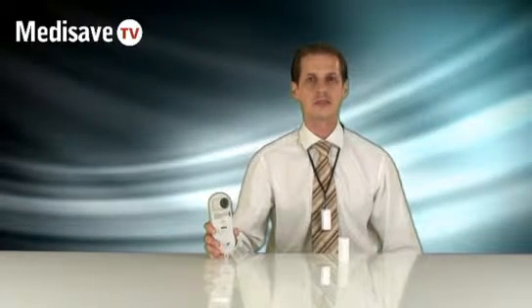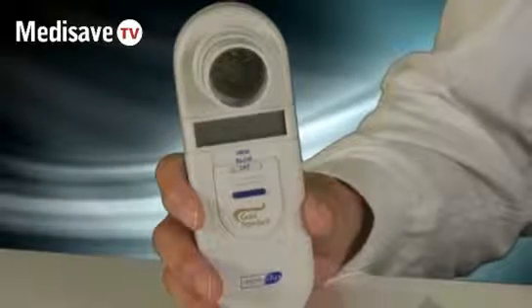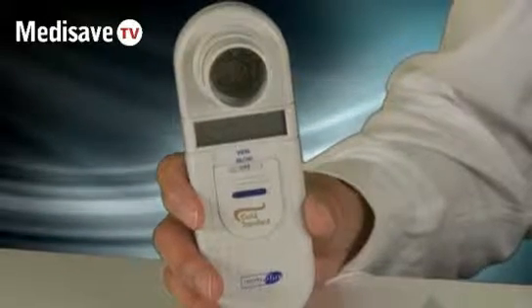Welcome to the MediSave demonstration of the MicroPlus Spirometer from MicroMedical. The MicroPlus Spirometer measures FEV1, FVC, peak flow, and will calculate the ratio of FEV1 to FVC.